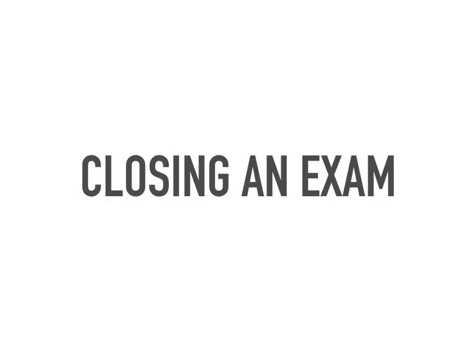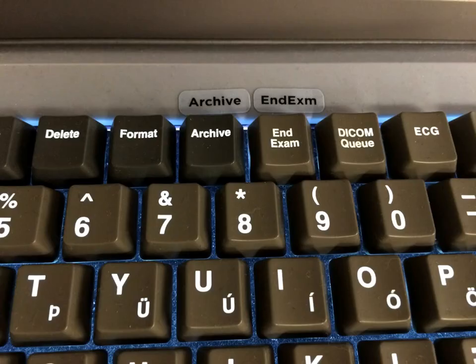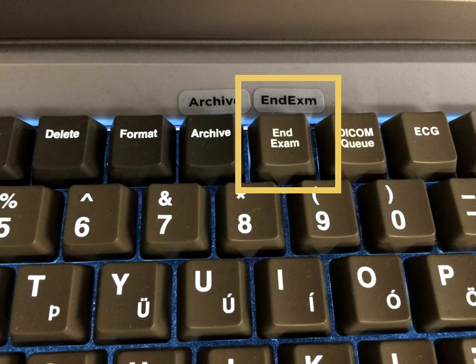Well, we are there finally, closing an exam. Tap the End Exam key at the top of the keyboard, and a pop-up box will appear that says something to the effect of, "Are you sure you want to close this exam?" If you do indeed want to close the exam, use the trackball to select Yes, otherwise select No. If you select Yes to close an exam, you will notice closed as the patient name will disappear from the top left corner of the screen.